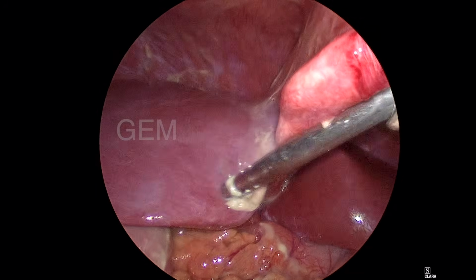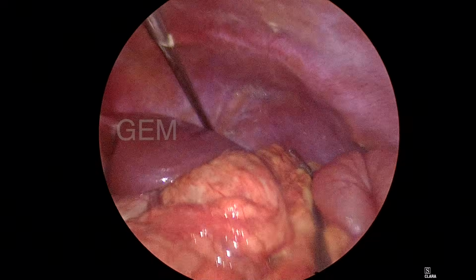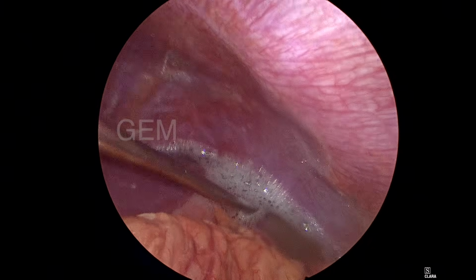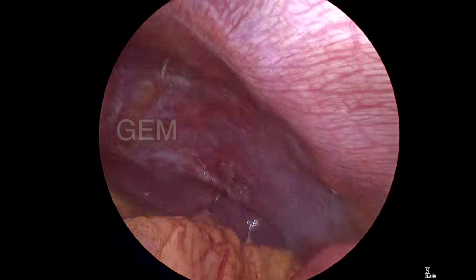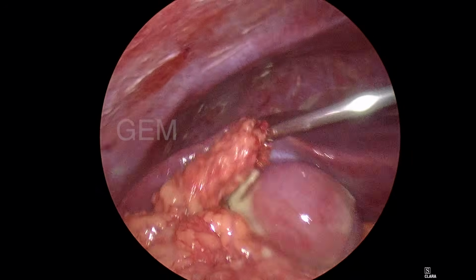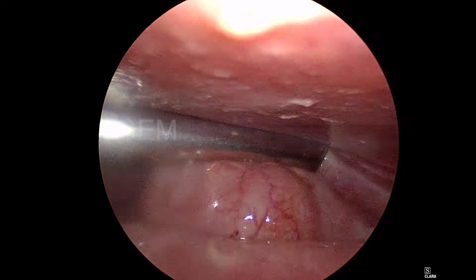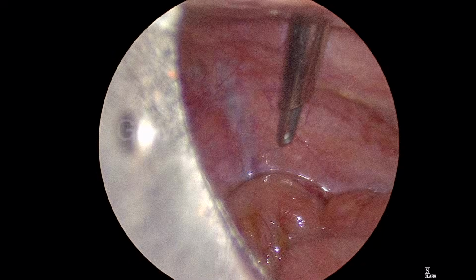Washing the peritoneal cavity is the key step, considered very important in generalized peritonitis. When laparoscopy was initially introduced, they told you that you cannot wash all the quadrants. Now I am showing all the quadrants and how I am washing, and you can see everything is cleared, all the infected material is cleared from the peritoneal cavity. So it is very well possible in any case, even DU perforation or any other case, we used to give a wash like this. We can wash the entire area. We have to spend half an hour, 40 minutes extra only on washing. And I use normal saline.